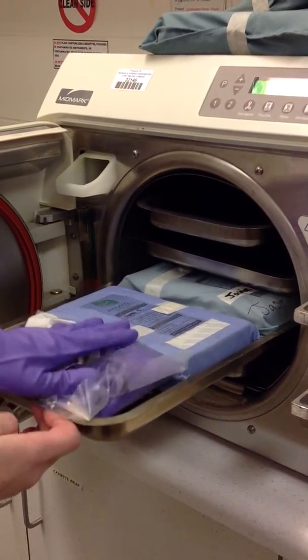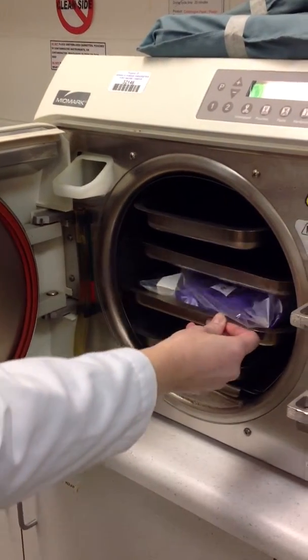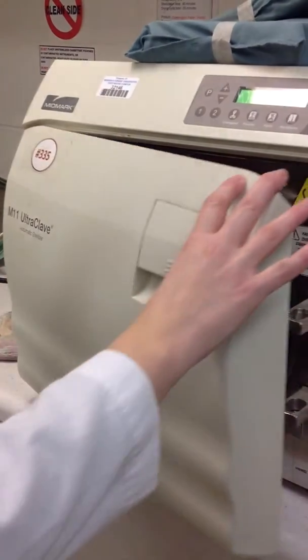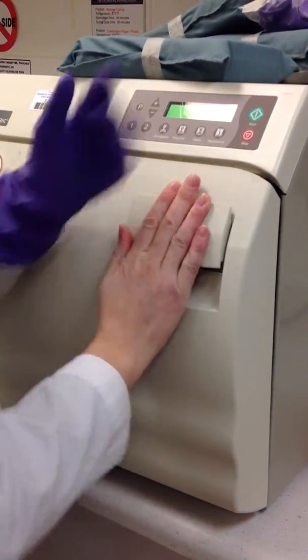We don't want to stack too many things on top of each other. Once all the racks are filled, you'll shut the autoclave the same way you opened it, by lifting it up on the tab and locking it into place.